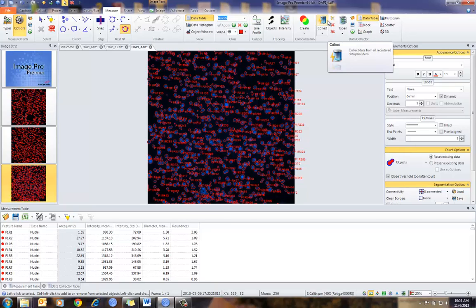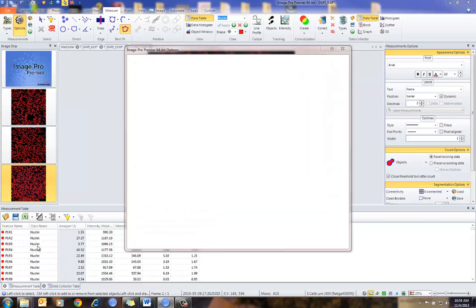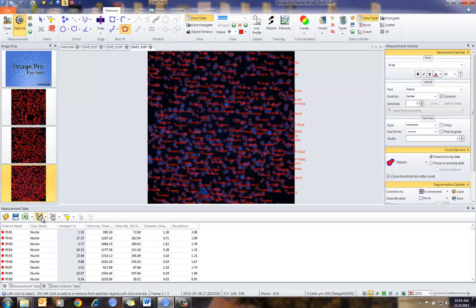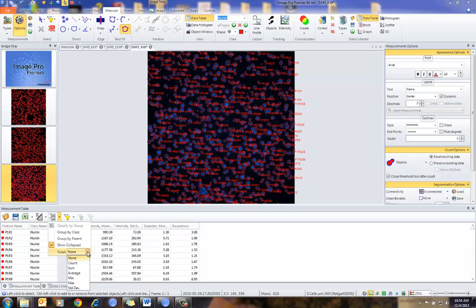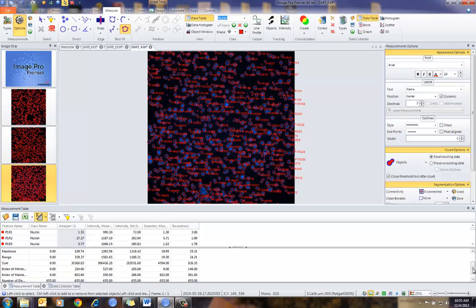At this point in Data Collector, I can do a couple of things. This has now accumulated the data from all three images. I can export this data by simply going to Excel — there are Excel controls here about how to send this information to Excel. By pressing this button, it will automatically export the data. I can choose to group the data in various ways by class. In this case, I only have a single class of nuclei. If I had multiple classes of objects — positive, negative — I can set that up to display them all by the proper class. I can show various information such as averages and standard deviations for the various measurement parameters I've counted. I can also, by pressing on the statistics button, show and hide the statistics panel, which will generate the statistics for all of the images together.